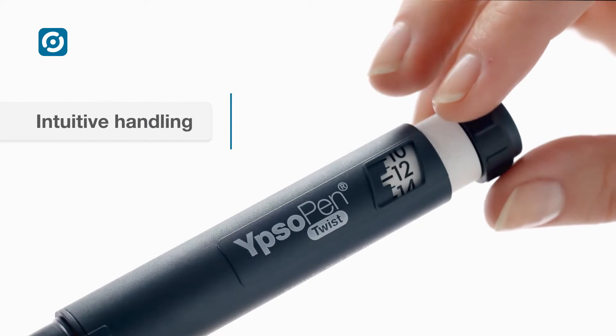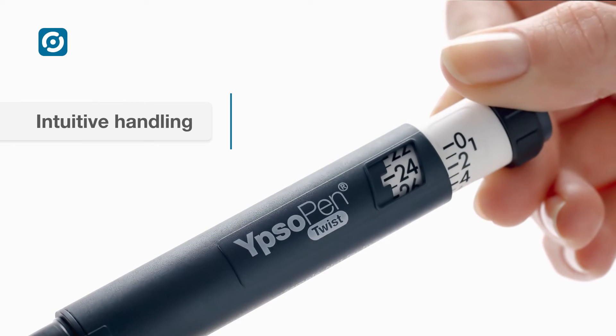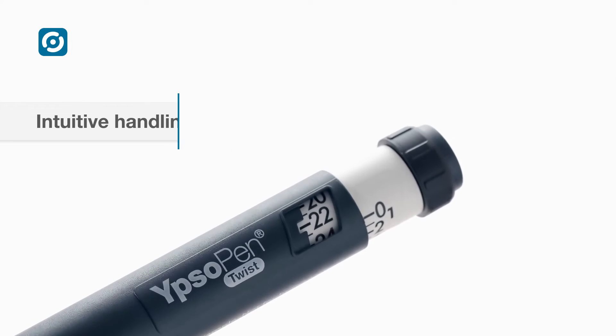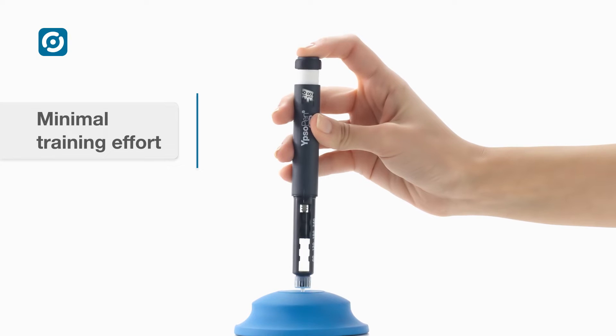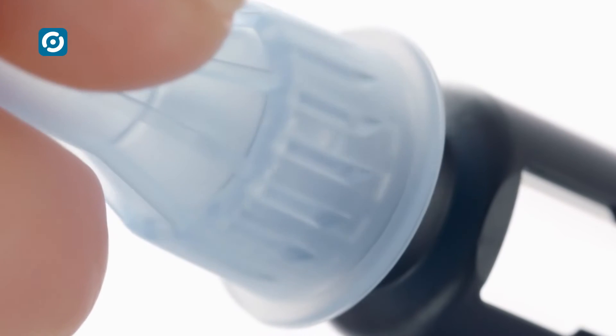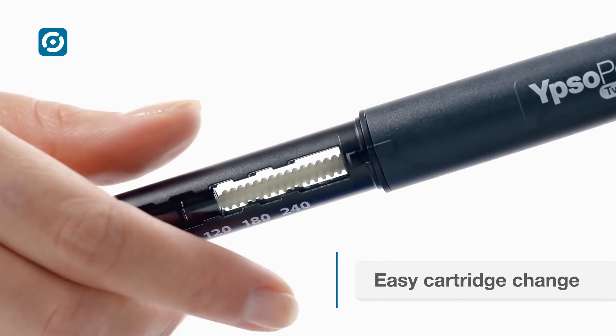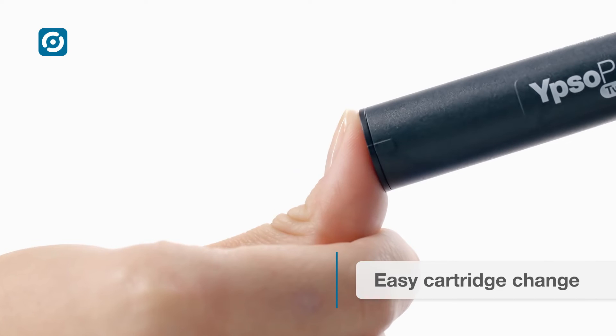The pen is intuitive to use. The dose is dialed with a single twist and easily corrected. The dial-and-dose handling concept guarantees a high level of patient acceptance and minimal training effort. The cartridge holder with bayonet connection makes cartridge changes quick and easy.